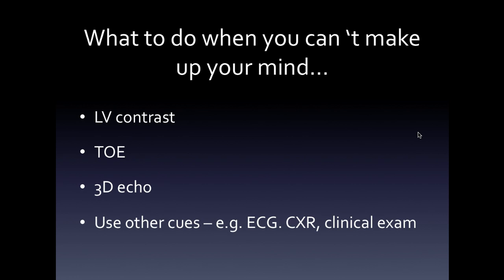There are lots of other things about TOE we could talk about, but because of the technical differences in frequency of a transesophageal probe compared to a surface probe, and because now our machines are so clever, they'll automatically change things like the pulse repetition frequency, the PRF. So if you have a patient and you see a lot of mitral regurgitation on a transesophageal echo, that may be entirely artifact because the PRF was changed automatically by the machine because it's a higher frequency probe. In other words, there's a lot of stuff that goes on in the machine that, unless you're really familiar with the basic fundamentals of ultrasound, which most of us aren't, quite frankly I'm not, you can actually get the wrong information because you make the wrong set of assumptions.